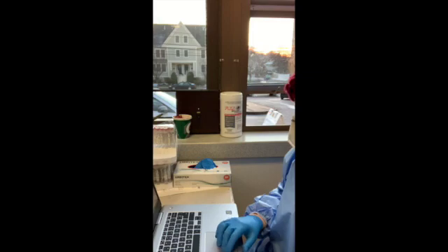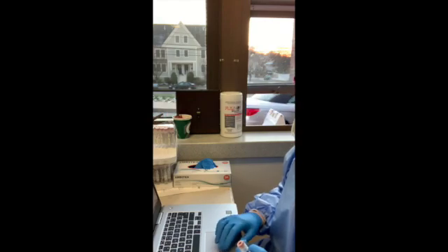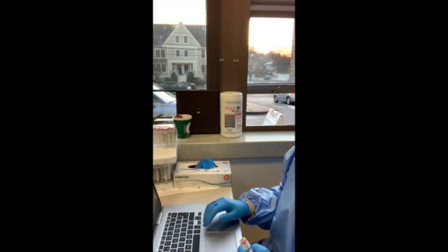Samples get delivered to the lab every day at around 2 o'clock, and they're processed usually overnight. Sometimes it takes a couple of days. But we found that our setup has been completely efficient.